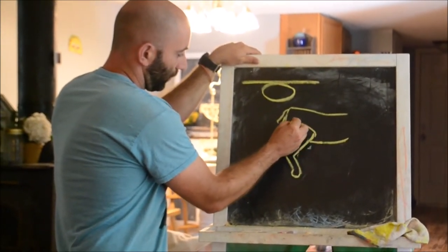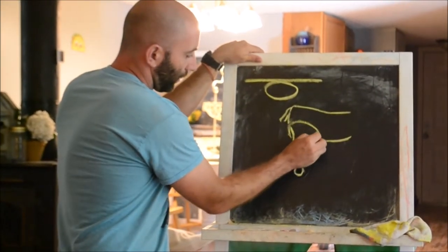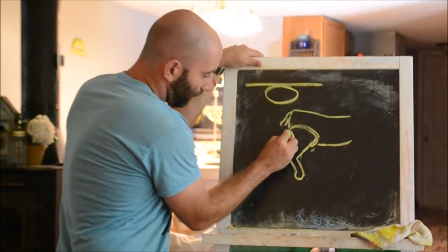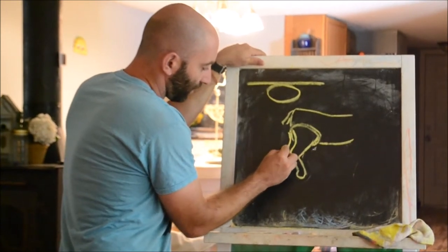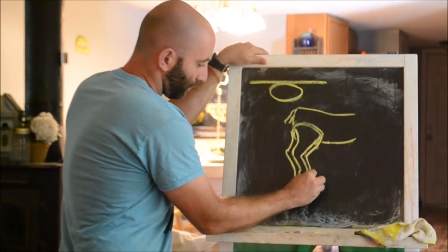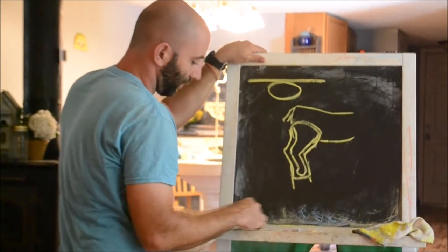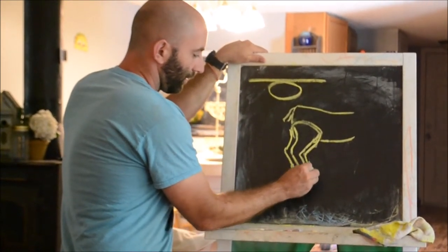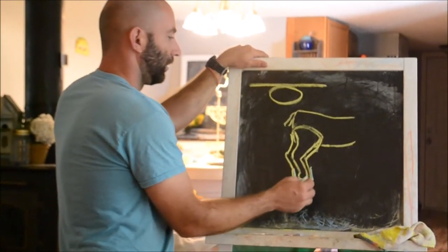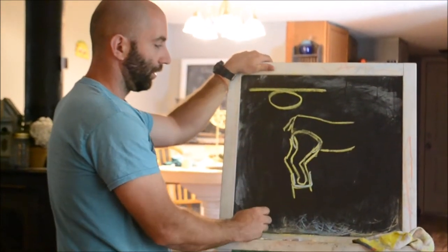It's going to go right there, come around, and then pull back around again here. You basically want to mold it so that it follows the curvature of the leg, on both sides. Probably longer — you cut off these end pieces and just make like a little shoe out of it. Then you would just tape it to the bottom of the leg. And that's how it's going to split the leg and kind of keep it immobile.